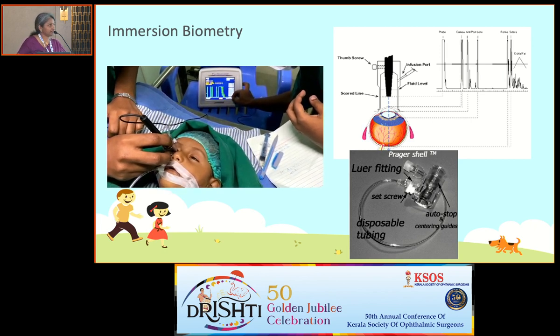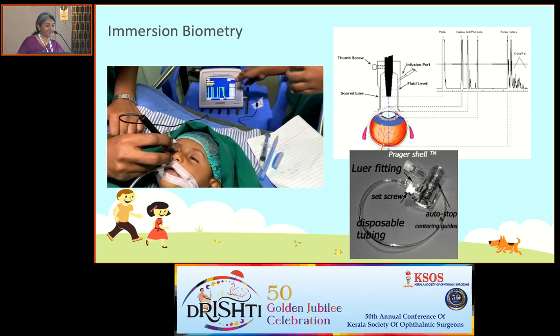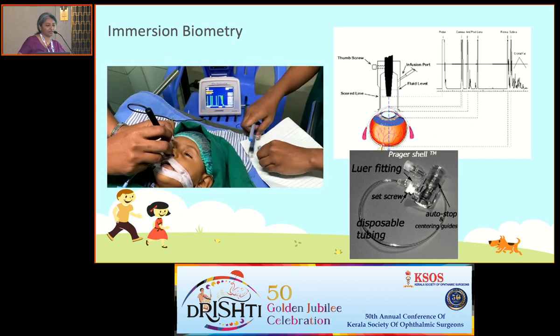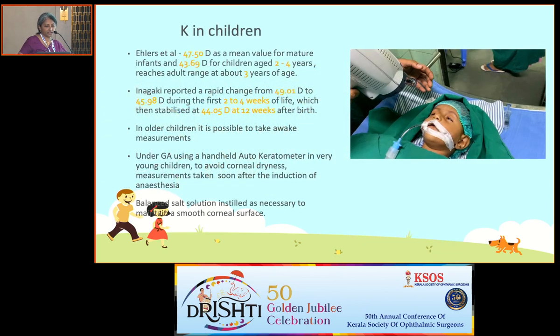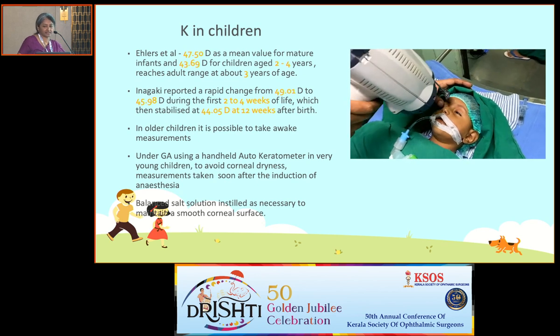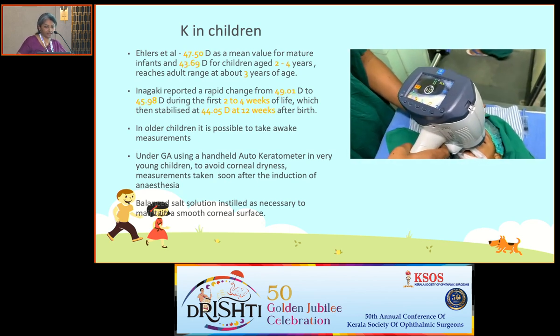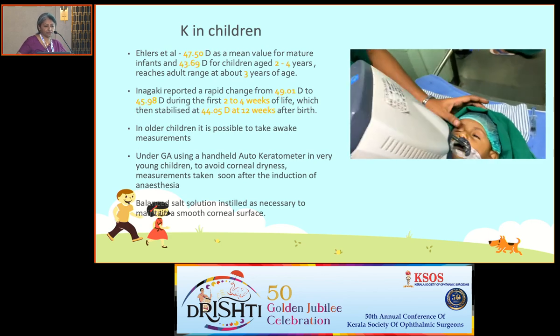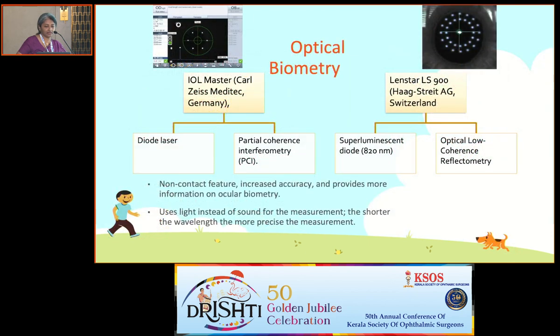So the immersion method is definitely much more accurate. In fact, we have a postgraduate thesis going on, and when we compare between the two, the immersion gives better values. So coming to the measurement of keratometry, you can see that this is a handheld keratometry device which is being used. Again, values are being recorded just before the child is going to be operated on. And with these instruments, it's very easy to get reliable measurements.